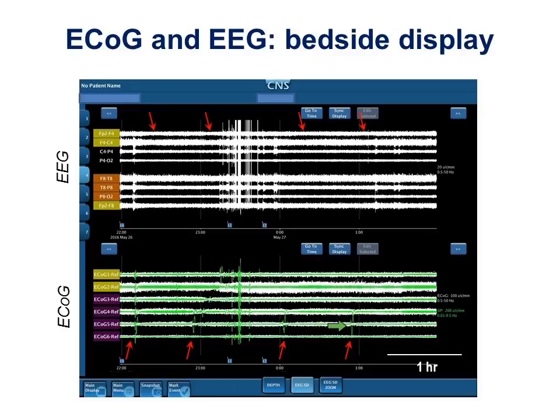And it's interesting in this case, if we look at the scalp EEG, if you squint a little bit, it helps, but you can see here this narrowing of the amplitude in the first 2 channels that occurs simultaneous with the depolarizations from the subdural recordings, and they match up 1-to-1 with one event here, 2, 3, and 4.